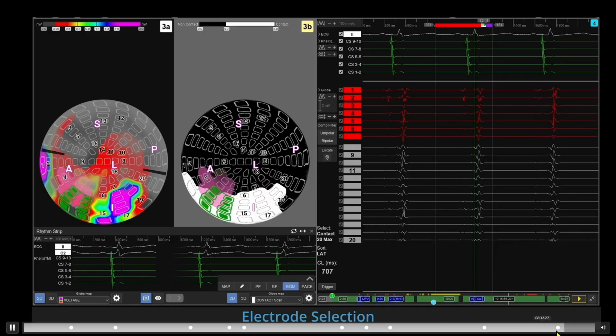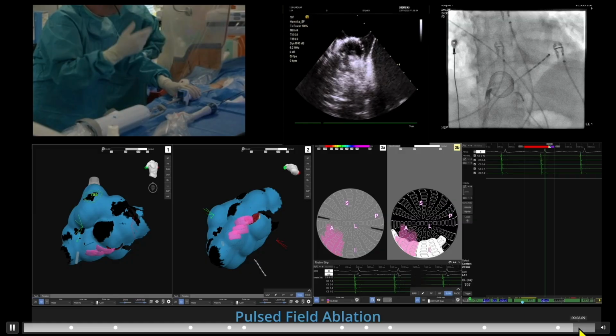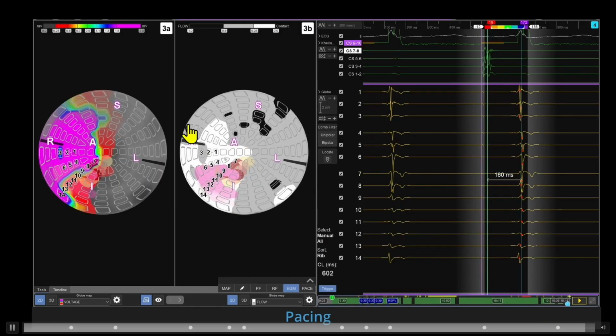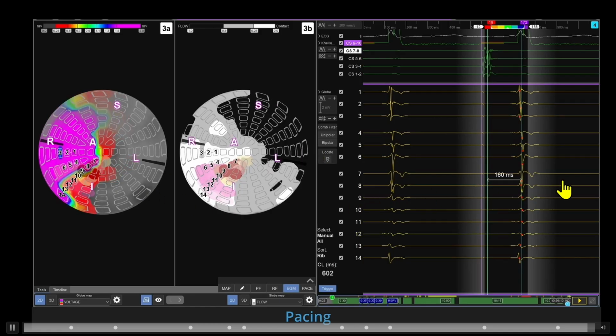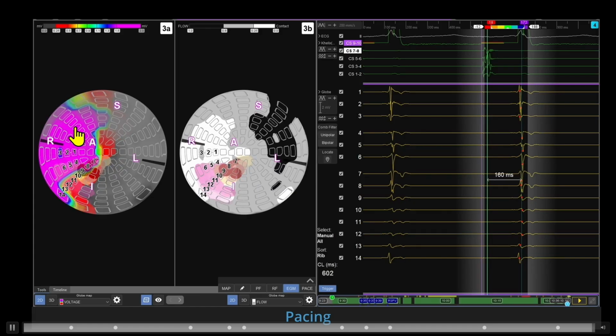Select the electrodes again. Deliver pulse field again. And finally, we can do pacing. So we can pace and then measure the distance here to the other side. Again, you can select any electrodes that you want here. You can actually pace, by the way, from any of the electrodes too.